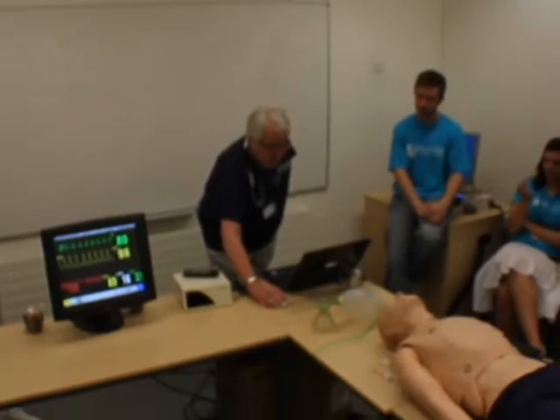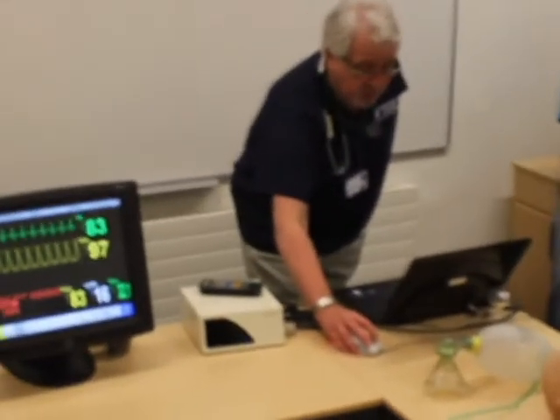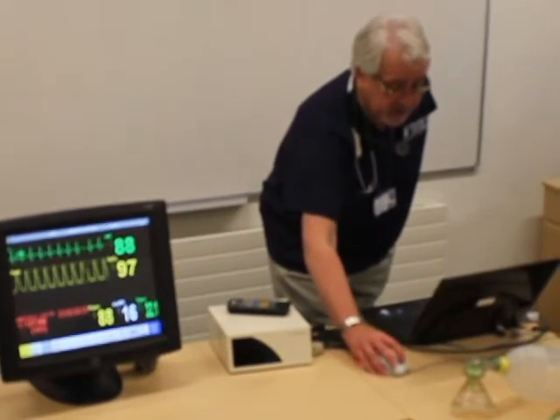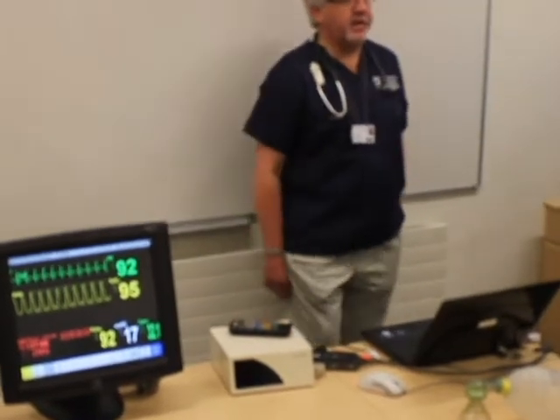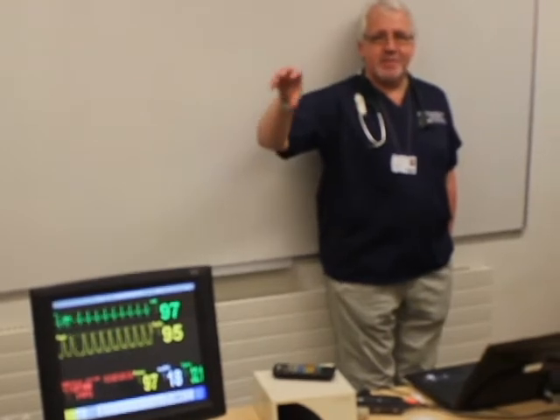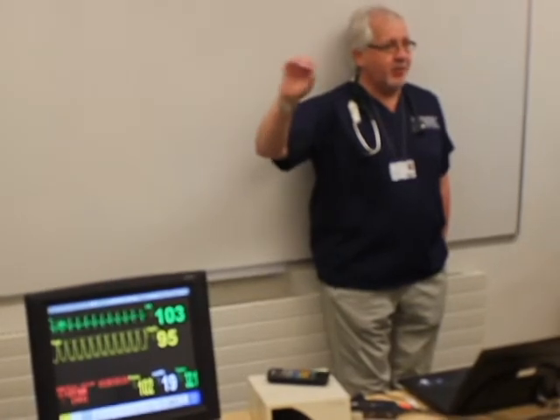So over the next couple of minutes he'll begin to go off in quite a significant way, and you'll notice that as his heart rate begins to climb up, oxygen rate will begin to decline, and then alarm bells will all start sounding, and that regular 80 per minute is now going faster. You may think that's just a bloody nuisance, that noise in the background, but it's actually telling us quite a lot. That's banging away much faster than it was 20 seconds ago.